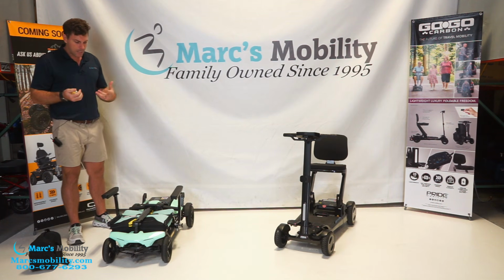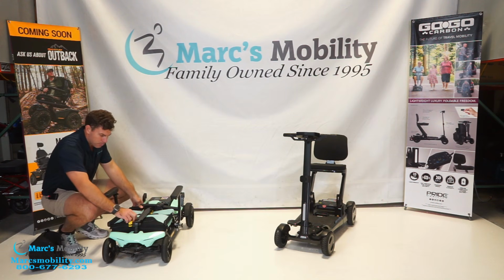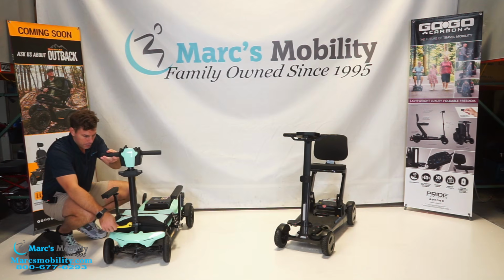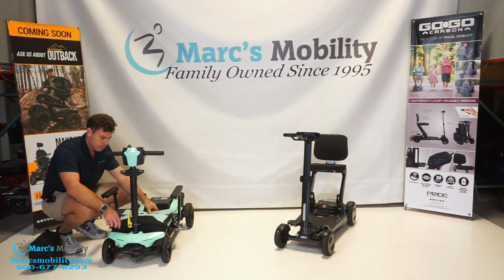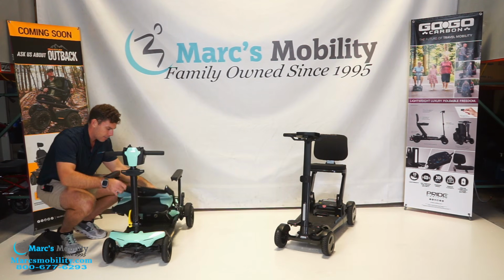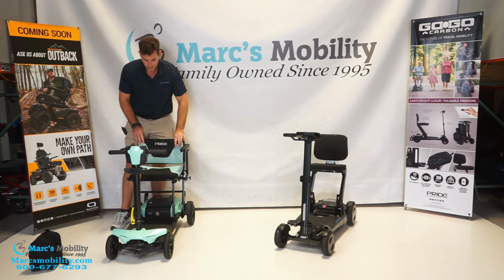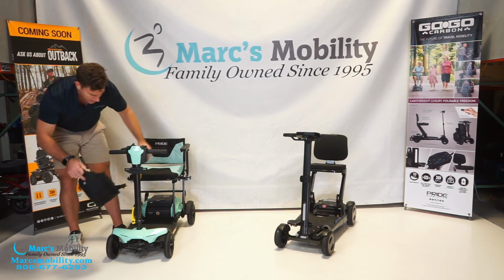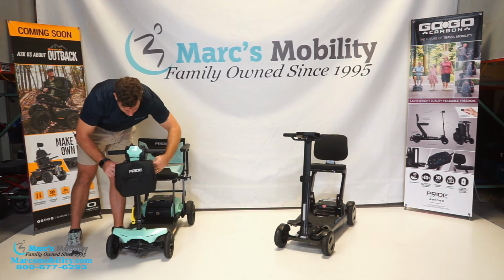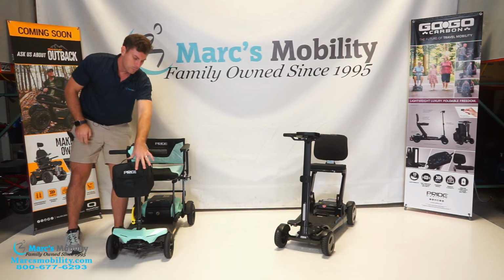So now to basically get it back to a normal driving position, you're just going to do everything backwards. You're going to pull this yellow lever here in the front, bring this to an upright position. And now from here, the same yellow lever that you grabbed to lower the seat down, you're going to lift that up again. And you're going to just rotate your seat backwards until you hear it click. Now this is going to be your upright driving position. And then from here, you can take the cover or the front storage compartment and put it back on to your unit with the Velcro that is supplied with the front bag.